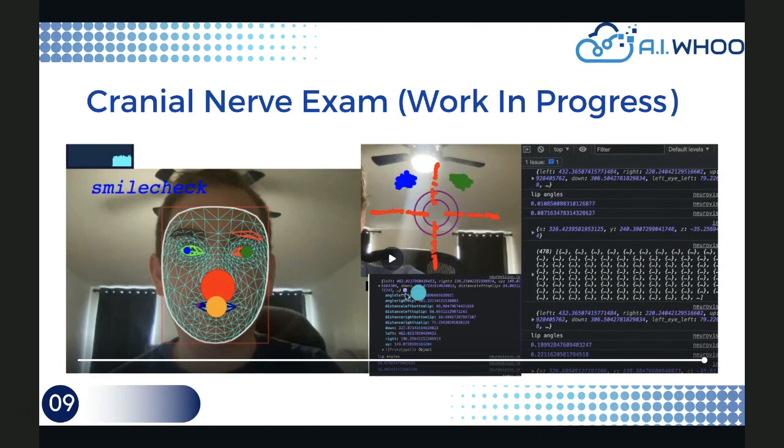But we can actually get some objective measurements. If my face is drooping a little bit to the right, you can see that the angle of my left side is slightly lower than the angle from my right side. Looking at those asymmetries will be very valuable in determining, first of all, whether an event happened, and second, after the fact, whether they are recovering and going back to their symmetrical face.